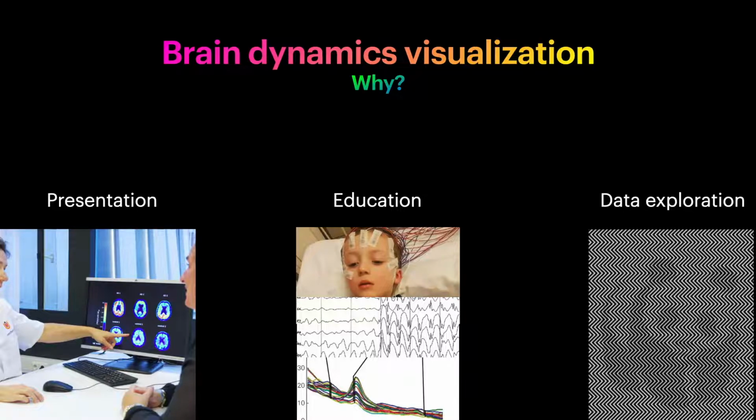And finally, I don't know if you can see the animal in the lower right square, as its image is rather unstable, but by versatile ways of showing complex brain dynamics, we might discover new meaningful patterns, ones that we would not immediately stumble upon when doing quantitative analysis. The naked eye is a powerful observer, and it is for that reason that visual evaluation still plays a large role. Alright, enough reasons. I may have convinced you.